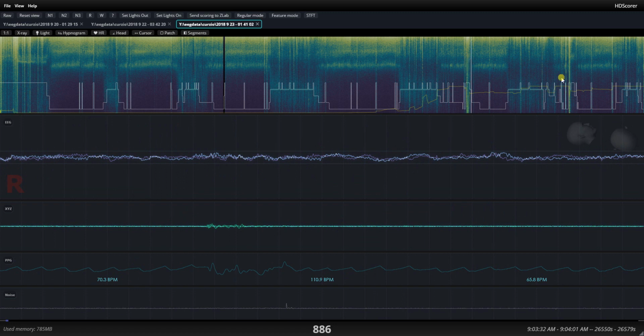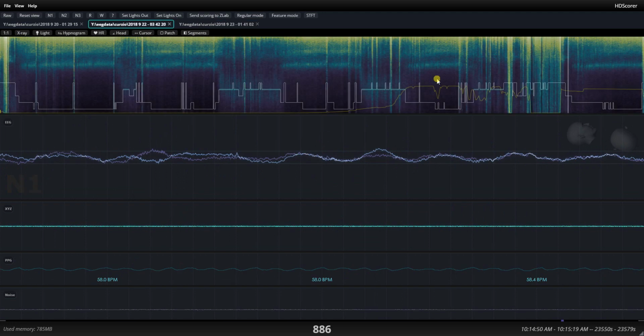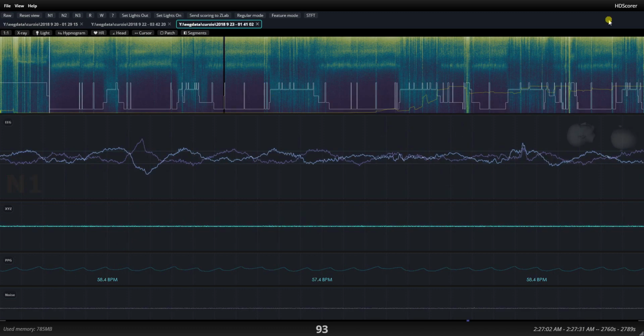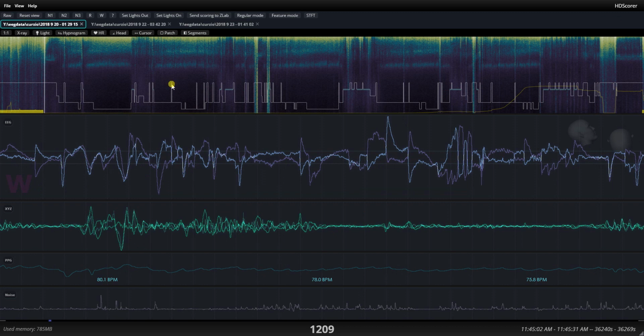Here I've got 6 sleep cycles, and I felt pretty good today when I woke up. The previous night I only had 4.5 sleep cycles. I felt not so good, and the first night I don't really recall, but there's one that got interrupted a little bit. Let's call that 1, 2, 3, 4, 5 sleep cycles. So it seems as if I need 6 sleep cycles for proper rest, which is what? 2.5 to 11. Yeah, 9 hours, as I've always known. I need 9 hours sleep. What a waste of time.